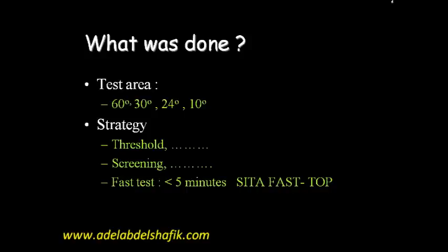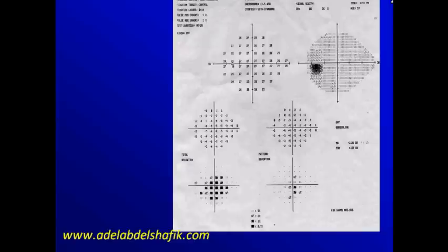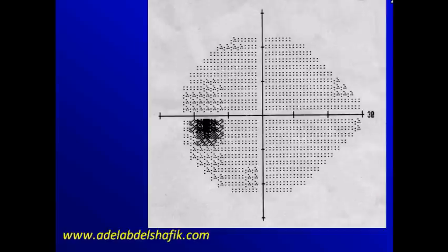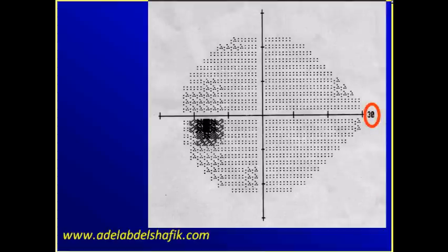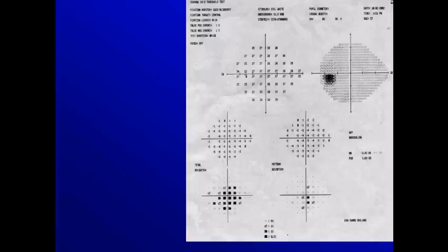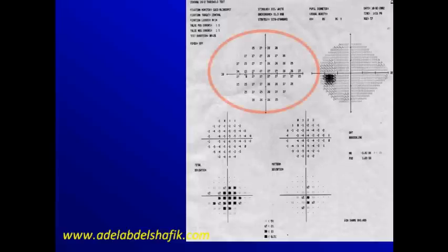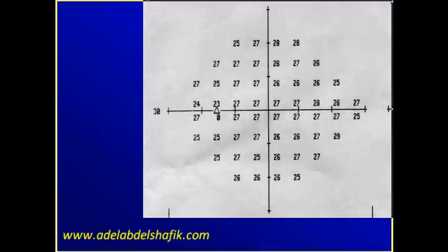Here this is the printout of the Humphrey. If you look at the gray scale here you can see we have a number here, 30, so this can be a 30 or 24 degree test. This is the location of the blind spot. The blind spot is to the left side of the vertical, so this is a left eye.